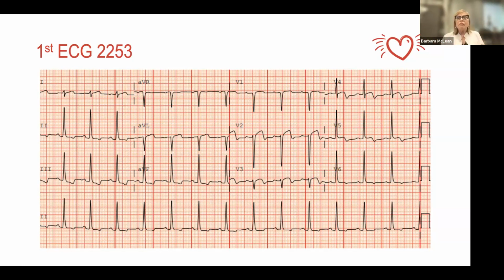Okay. Second thing I'm going to look at is, does his QRS, either on the right side, V1 representing the right or V6 representing the left, does it take longer than normal for depolarization?